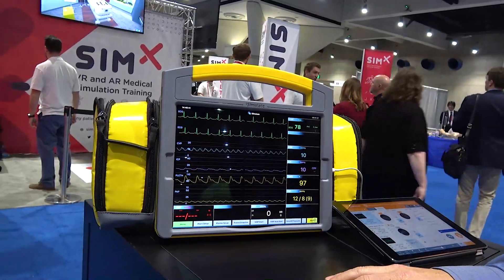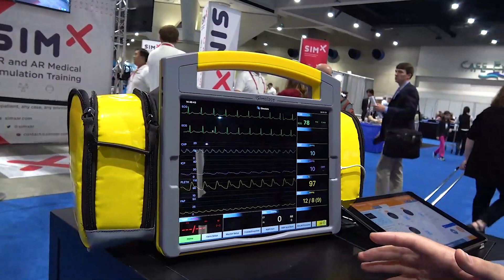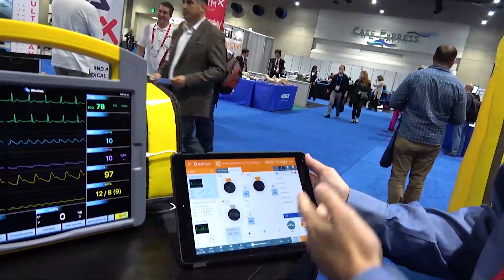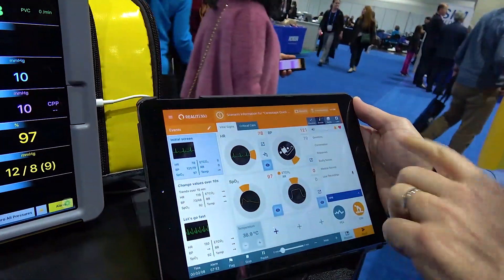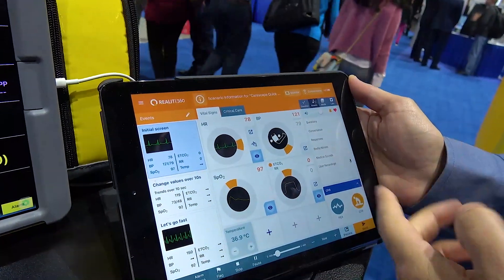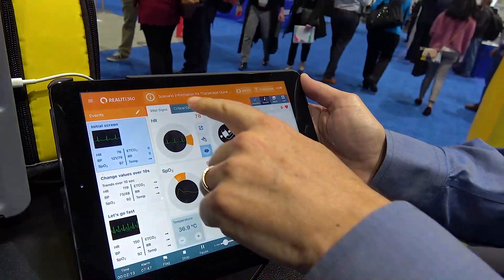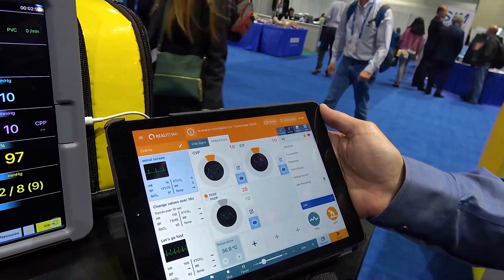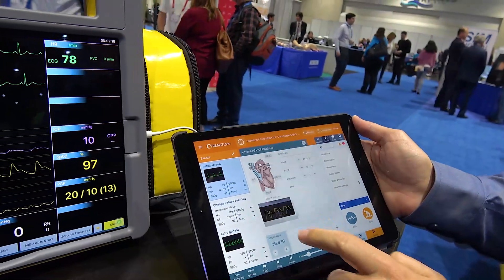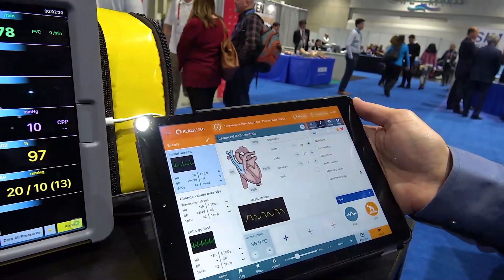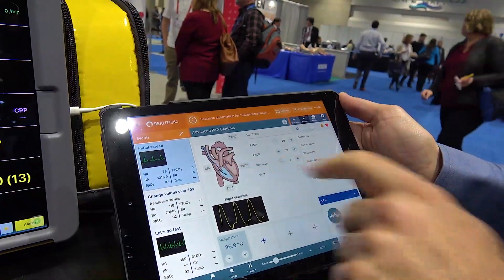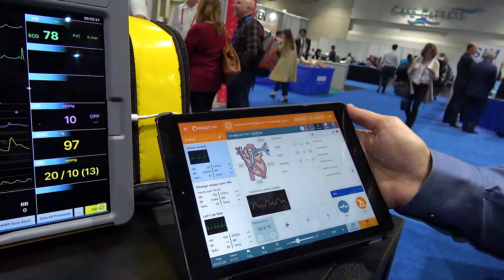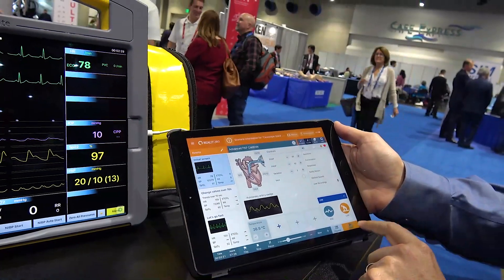We've had to modify the controls ever so slightly, so as well as the vital signs — heart rate, blood pressure, SPO2, CO2, and respiratory rate — we've now got a new tab which shows CVP, ICP, and PAP. We've really worked on the controls so you can float the catheter through different parts of the heart and even wedge it.